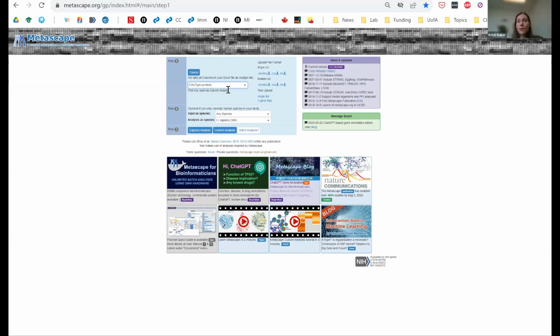I took these from a public data set that I exported, and I basically just downloaded the data in an Excel format. I created an Excel file and uploaded it into here. I did choose, so if you have multiple genes, you want to make sure you choose this multiple list option.